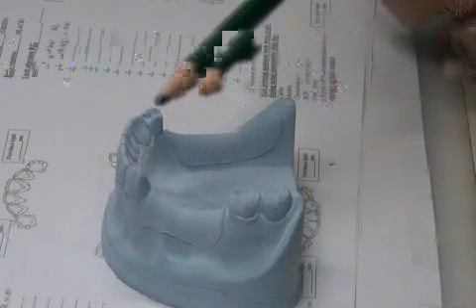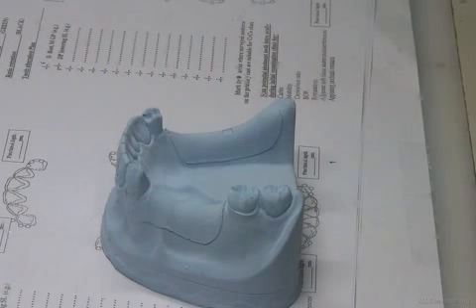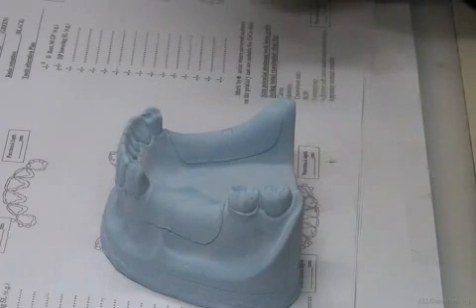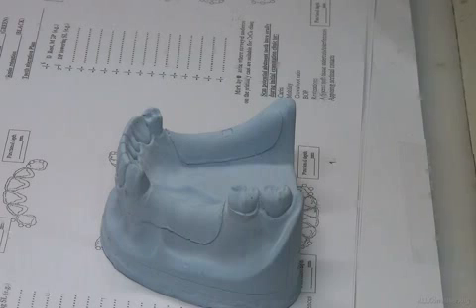But in action, this also happens, and we place a mesh in bounded areas. And bounded areas are okay with mesh, and usually we don't have a lot of resorption. This is the idea about bounded areas. Not a lot of resorption happens. That means we need a place for teeth, and we usually put mesh there. Okay? We don't find places to place the teeth in the interocclusal spaces. So this is the design. We changed from the original design to another design. Okay, ready? So the idea is now clear. One of the indications for changing it here is aesthetics. Okay. Let's move on now to the case.